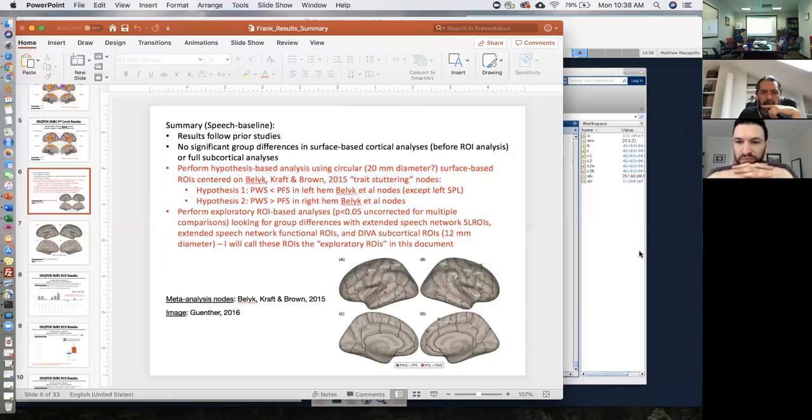Right. I mean, in this circular surface. So these coordinates that you have right now, they are the ones that you are attempting to use, basically the ones that are being displayed in that plot. Yes. The meta-analysis. Okay. I think those coordinates might have been originally defined in the MNI space, right? They have only been projected to the surface for plotting purposes in here, but they were originally defined in the MNI space because they probably come from other studies which, in the publication, were defined in Talairach space, and then I converted them to MNI.